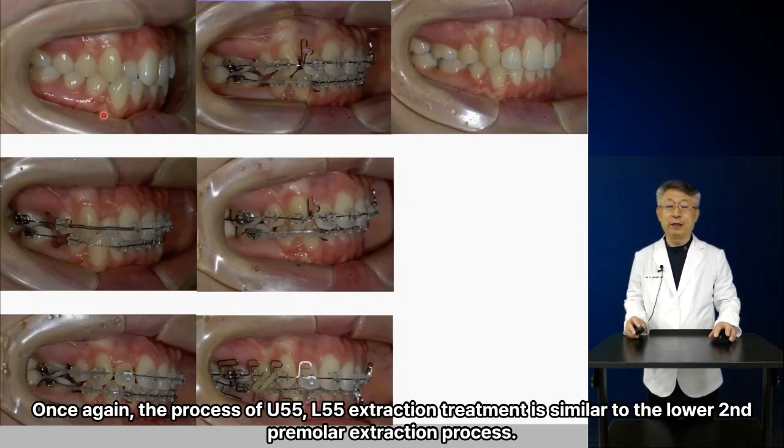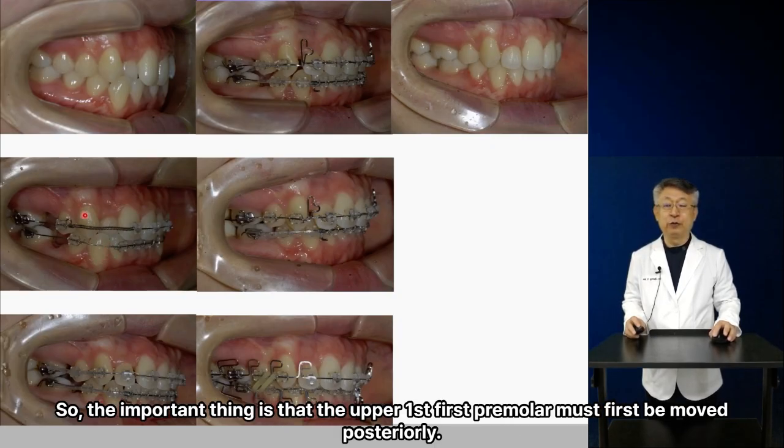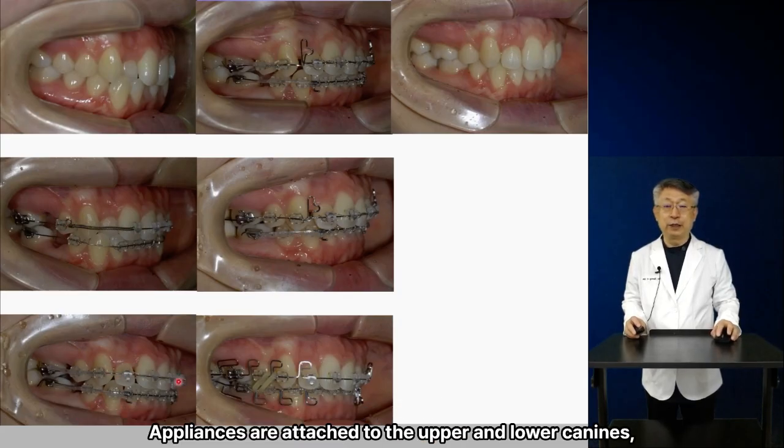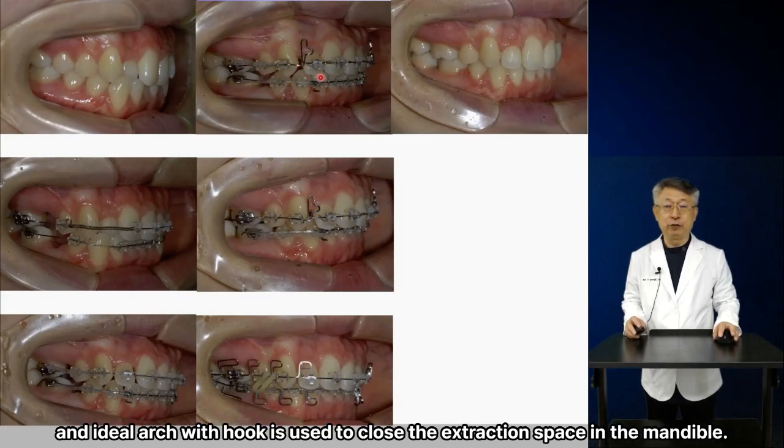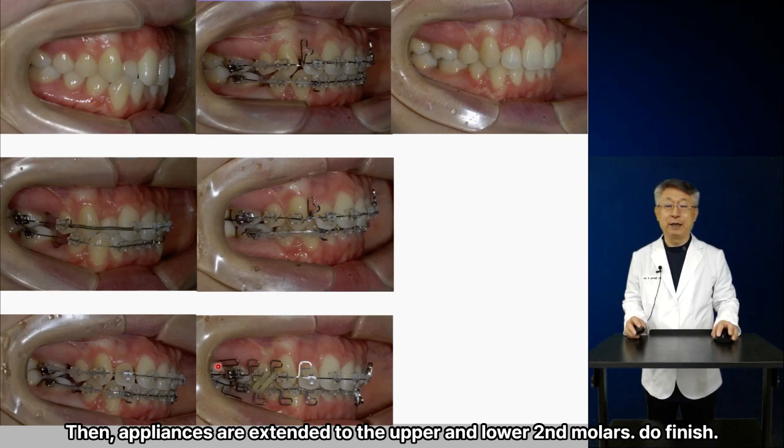Once again, the process of U55, L55 extraction treatment is similar to the lower second premolar extraction process. So, the important thing is that the upper first premolar must first be moved posteriorly. Appliances are attached to the upper and lower canines, and the combination loop or ideal arch with hook is used in the maxilla, and an ideal arch with hook is used to close the extraction space in the mandible. Then, appliances are extended to the upper and lower second molars.